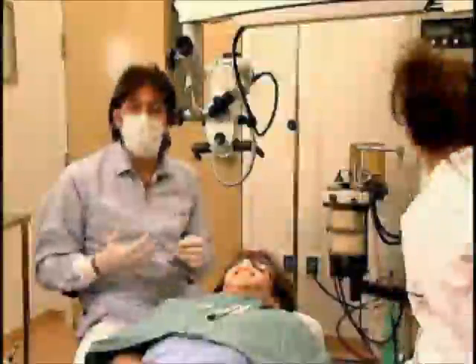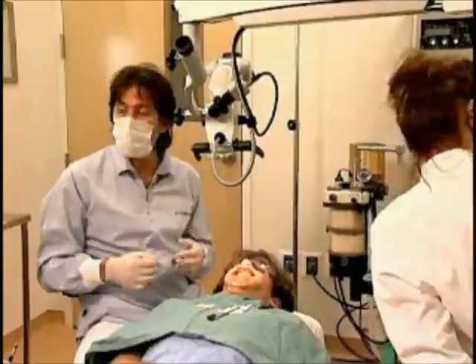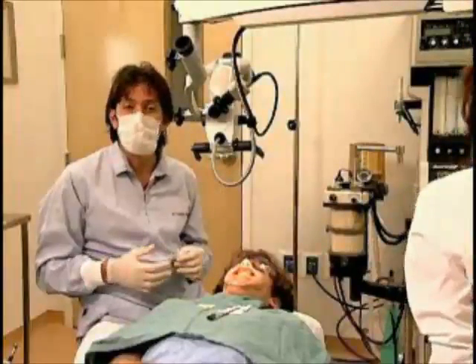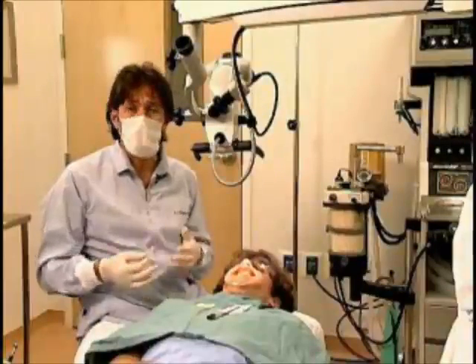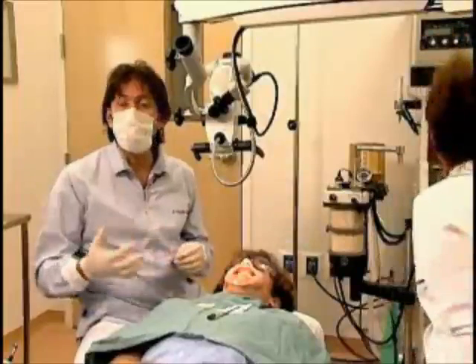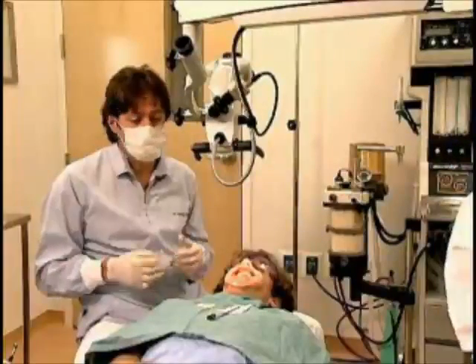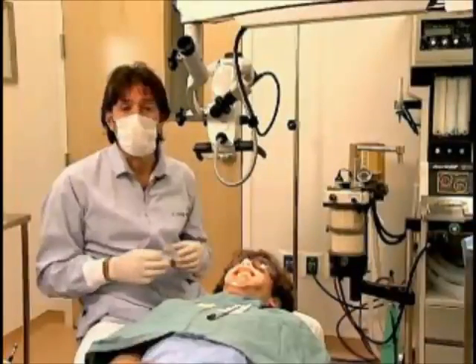Anatomy, soft tissue, angulations of his teeth, and it really allows us to treatment plan this case completely prior to ever sitting the patient in the operatory. So all the hard work in planning the implant diameters, lengths, sizes, as well as the abutments and the restorative protocol was done preoperatively, allowing us to take this to the mouth knowing, without even raising a flap, without even starting the surgery, what the bone will look like and what kind of issues we're going to be involved with. This is really completely different than two-dimensional radiography, which was historically what we had in dentistry.